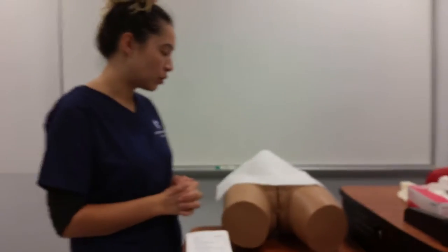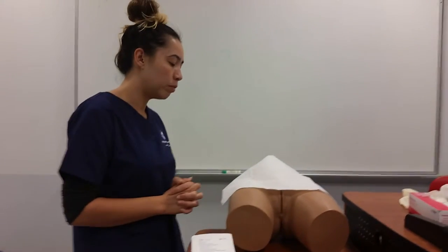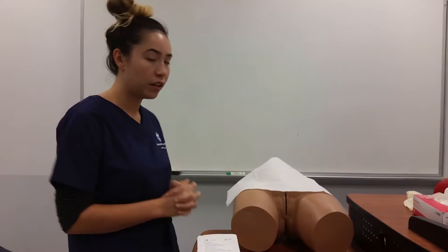Mrs. Smith, my name is Kerry Solon. I am a student nurse and I will be inserting your catheter today. First thing I would do is provide privacy by closing the door and pulling the curtain.